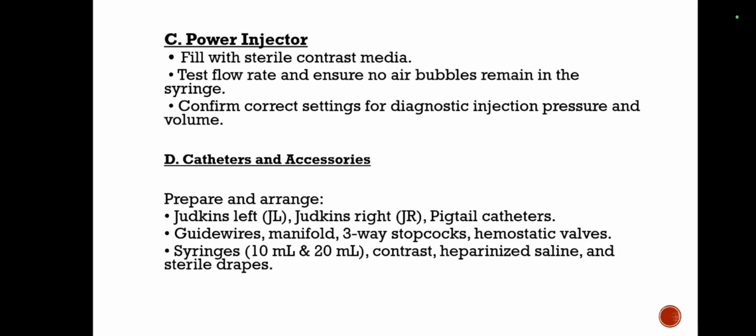Next is the power injector. If a procedure needs this power injector, we have to fill the power injector with the sterile contrast media. Next we have to test flow rate and ensure no air bubbles remain in the syringe. Confirm correct settings for diagnostic injection pressure and volume.